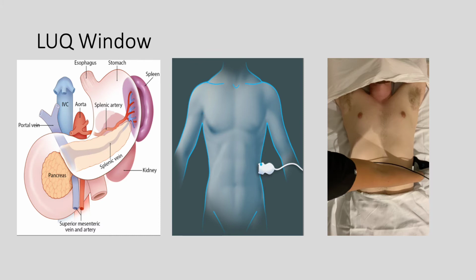The spleen is a bean-shaped lymphatic organ that is located in the posterior lateral aspect of the left upper quadrant of the abdominal cavity. The spleen is typically located just lateral to the stomach. The spleen sits deep to the 9th through 11th ribs along the left lower chest. The diaphragm is located just cephalad and posterior to the spleen. The normal adult spleen is entirely within the peritoneal cavity.